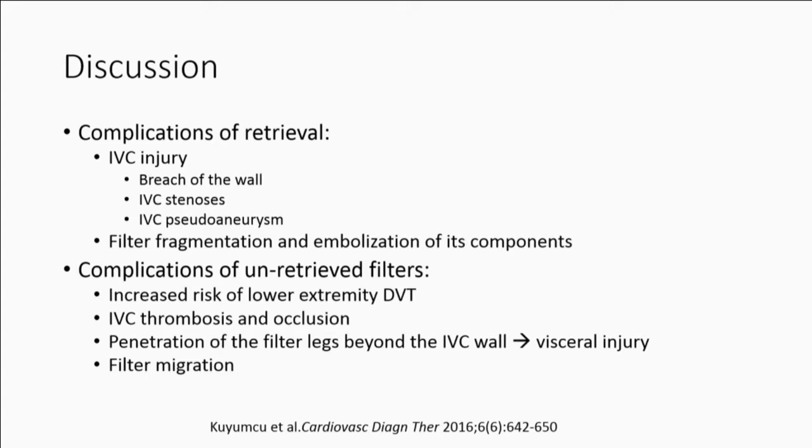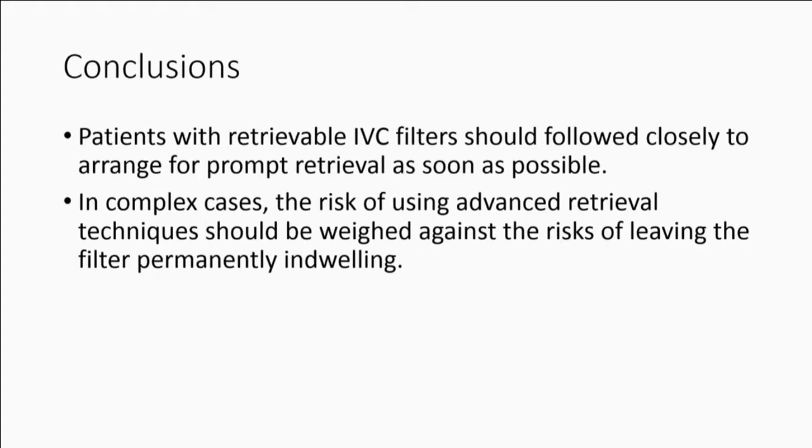IVC thrombosis can happen in up to 4% of the cases. Penetration of the filter legs beyond the IVC wall with visceral injury occurs in less than 1% of the cases, and filter migration, which is surprisingly reported in 20% of the cases, especially cranially. So in conclusion, patients with retrievable IVC filters should be followed closely to arrange prompt retrieval. And in complex cases, the risk of using advanced retrieval techniques should be weighed against the risks of leaving the filter permanently indwelling. Thank you.